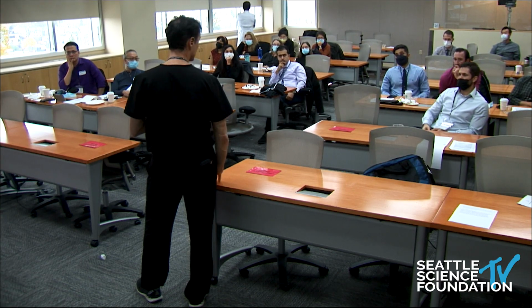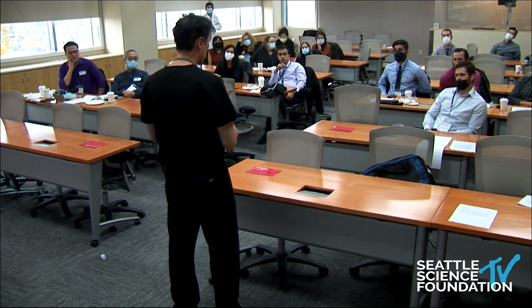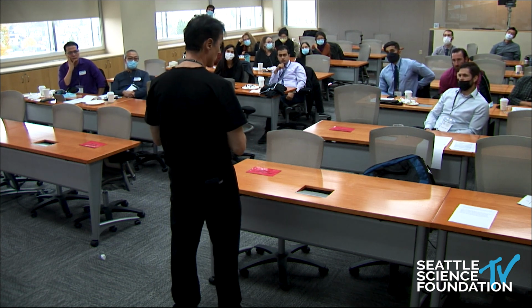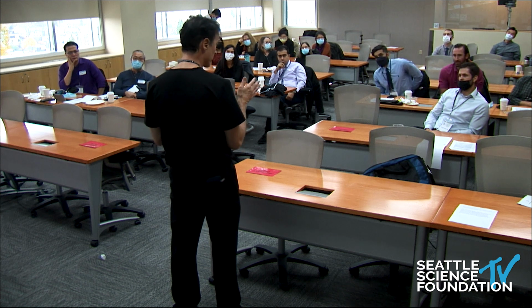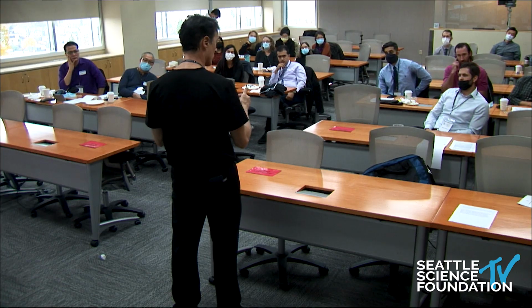Excellent. Do you always go bilateral, or do you do unilateral? We do unilaterals all the time. I mean, I go unilateral, bilateral about 50-50. If I'm able to accomplish the goal unilaterally, I'll do that. The goal is maximum height restoration, fill cement between the pedicles from end plate to end plate, and to be able to accomplish those things. If you're able to do it unilaterally, that's fine. I'm not always able to do it unilaterally.